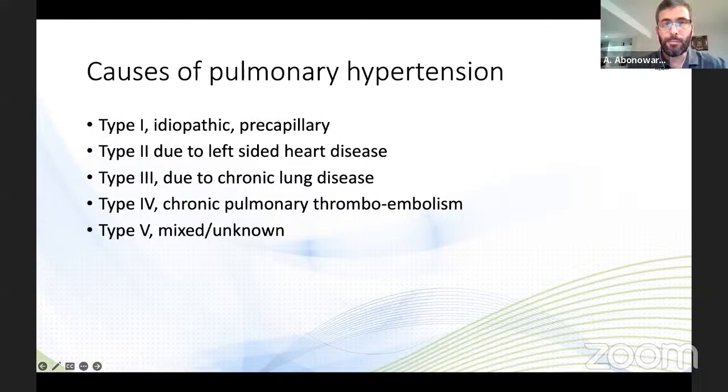Yeah, I agree with you, Basem. I think you just give yourself time and move up and down. So if you can't wedge from a certain area on the right side, move to the lower lobe of the lung, or move to the right pulmonary if you're on the left, and vice versa.